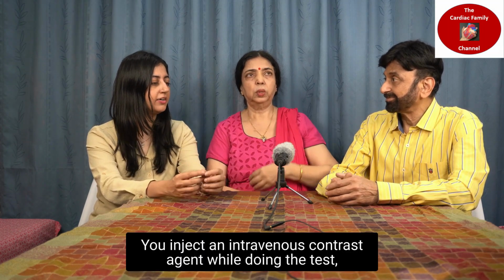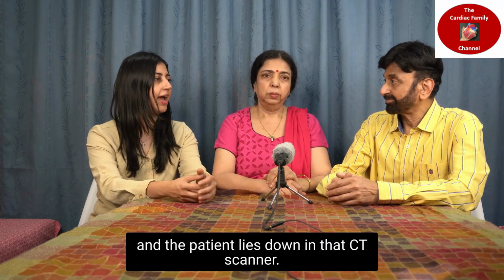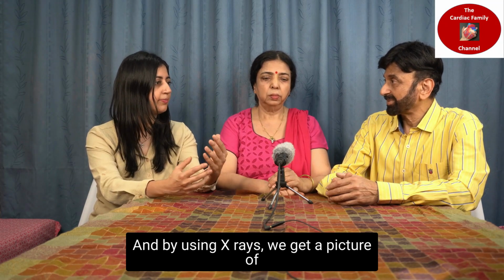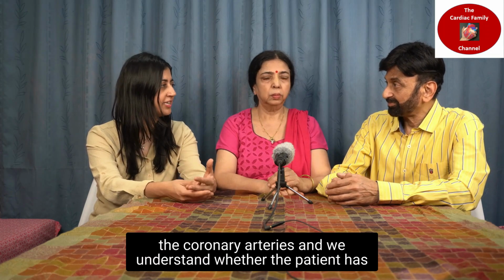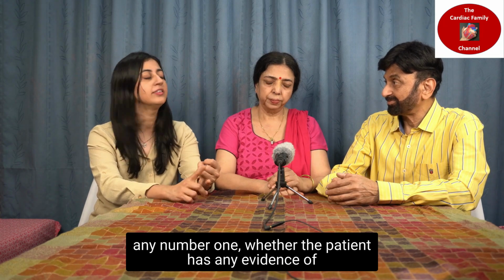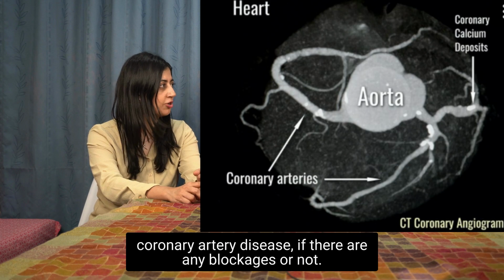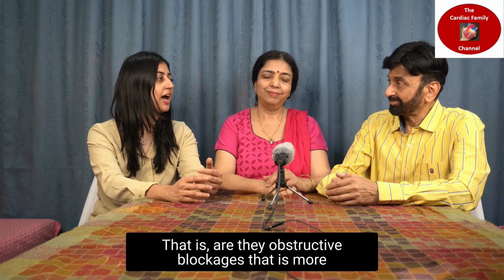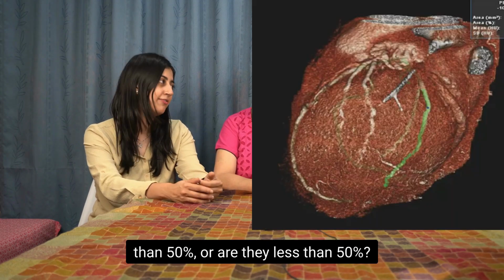You inject an intravenous contrast agent while doing the test, and the patient lies down in that CT scanner, and by using X-ray we get a picture of the coronary arteries, and we understand, number one, whether the patient has any evidence of coronary artery disease, if there are any blockages or not, and are these blockages significant or not. That is, are they obstructive blockages, that is more than 50%, or are they less than 50%?